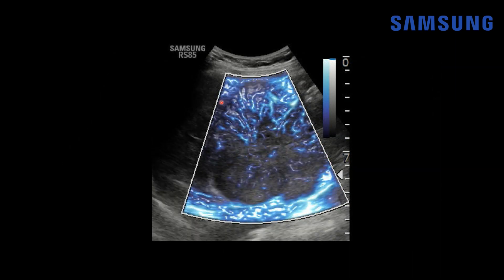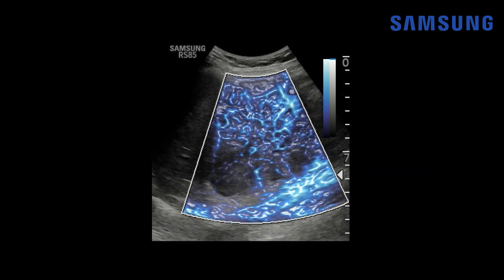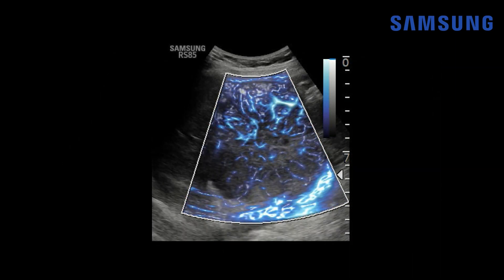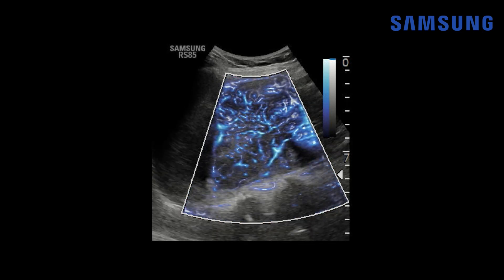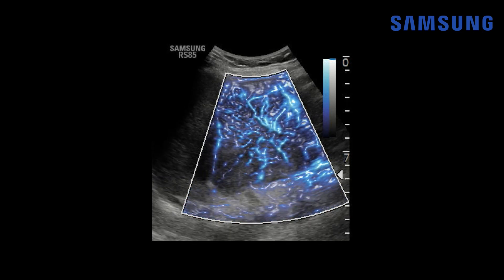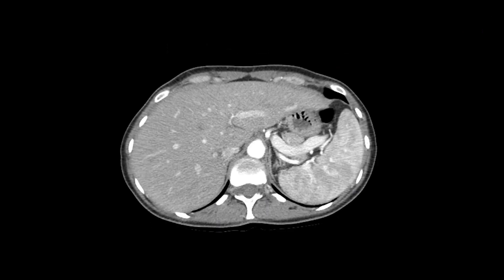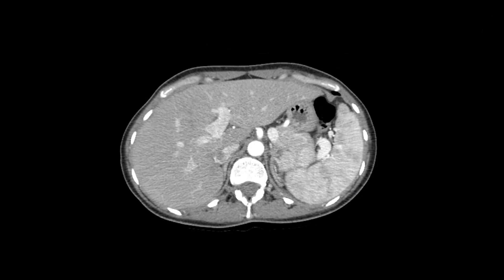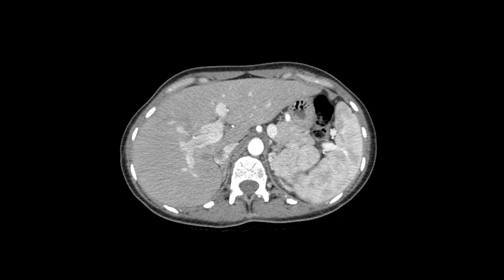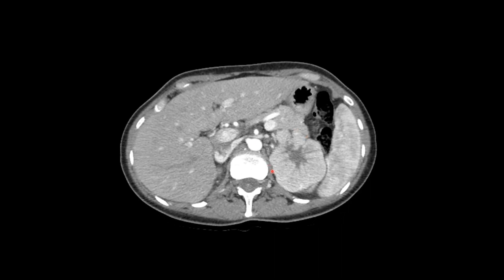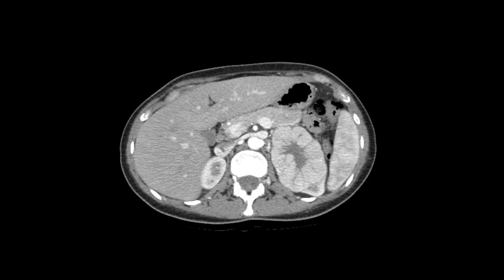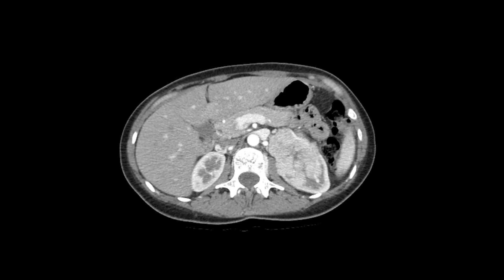Looking at the sine clip of microvascular flow, that spokewheel configuration of vessels and the peripheral feeding vascularity are clearly demonstrated. This patient also had a contrast-enhanced CT scan of the abdomen. You can see contrast within the abdominal aorta, and there's the mass with its lobulated contour, solid peripheral component, and central hypodense stellate scar, arising from the left kidney.